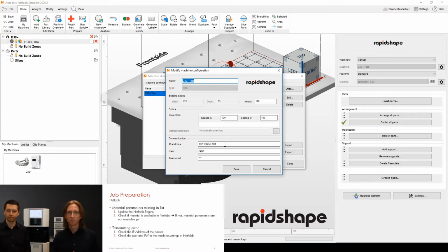So then again, this was the first reason what could go wrong, wrong IP address. Just go back to the machine, cross-check the information. Obviously, it must be the same. So the second reason could be that the username is incorrect. The username is always Rapid. It doesn't matter which machine. Let's assume you have like 2, 3, 4 machines at a customer site. All of these machines have the same username in the machine settings. So this is correct, obviously.